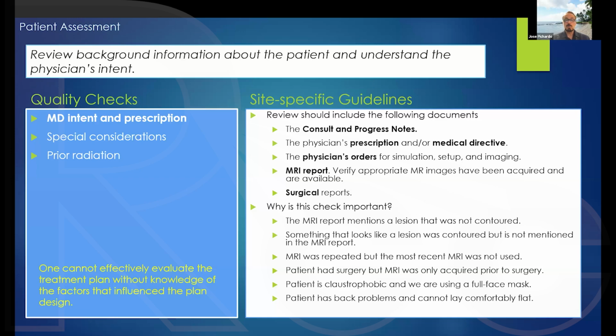Maybe the MRI was repeated, and the image that is most recent was not used in contouring or planning. It's also possible that the patient had surgery, but the MRI that you're looking at was acquired prior to the surgery.